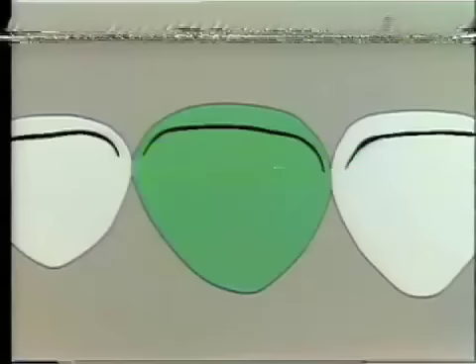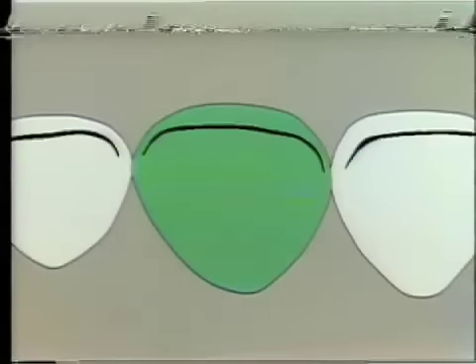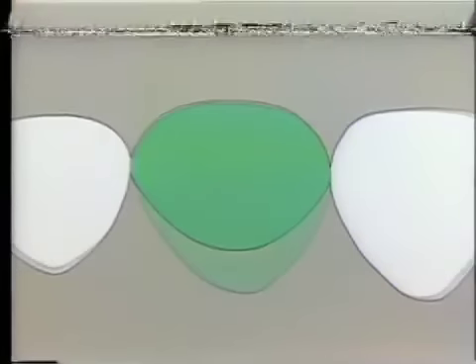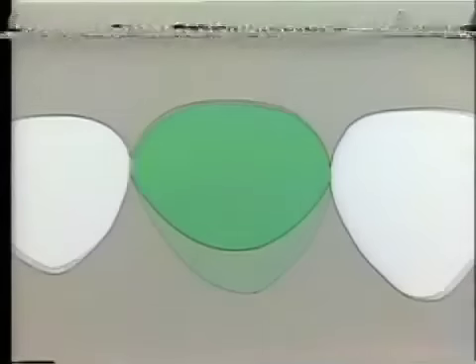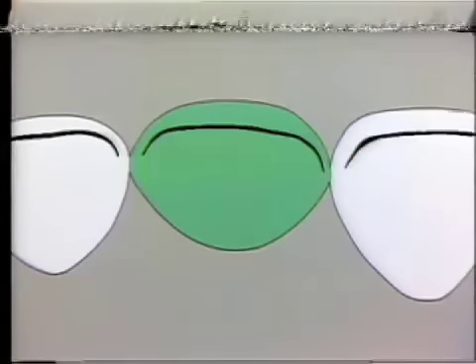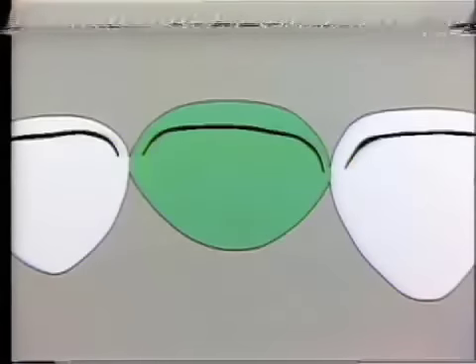This diagram shows a horizontal cross-section through a maxillary central incisor and shows the normal anatomical form of that tooth. Modification is made to this to convert it into a Pontic form by adjusting the lingual surface of this tooth. The lingual embrasures are opened as shown in this fade-in on the screen. This opens the interproximal embrasures on the lingual surface, gives good access to the underlying tissue and to retainer margins and the contact areas.